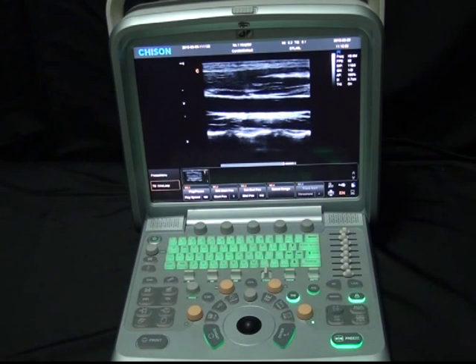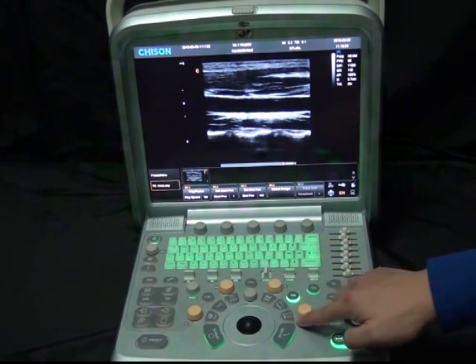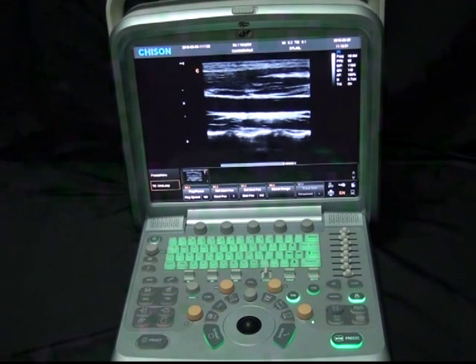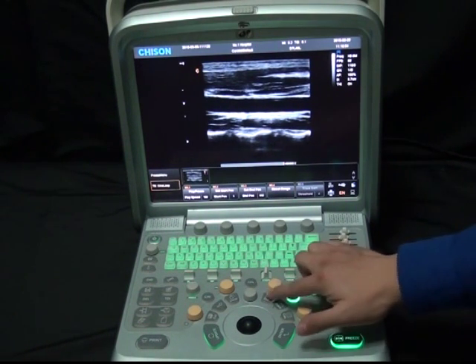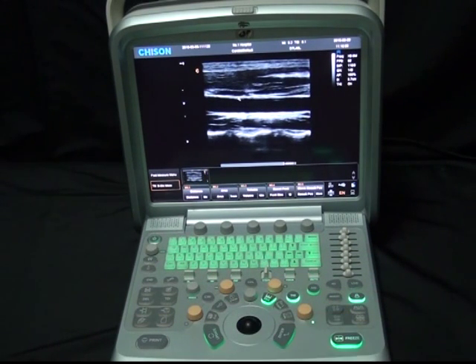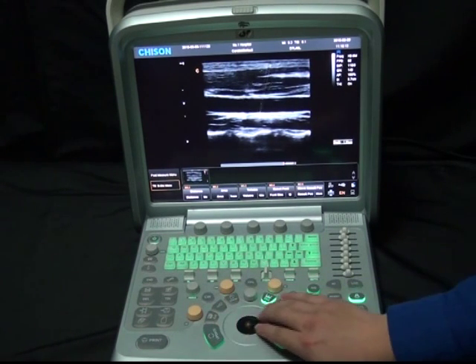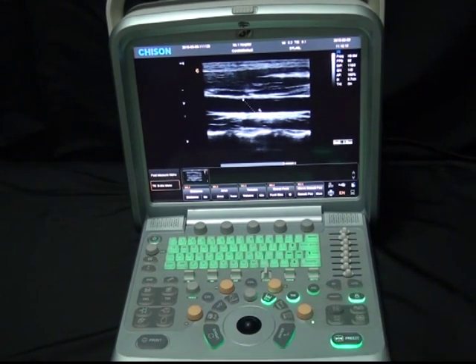Part 3: Measurement, Annotation, Bodymark, and Save. After getting a high-quality image, we need to do some measurements. We have fast measurement and calculation package measurement available. Let's take distance measurement as an example. Press the Dist button — you will see line segments on the interface. Press Update to change the active point. Move the trackball and press Enter to confirm.